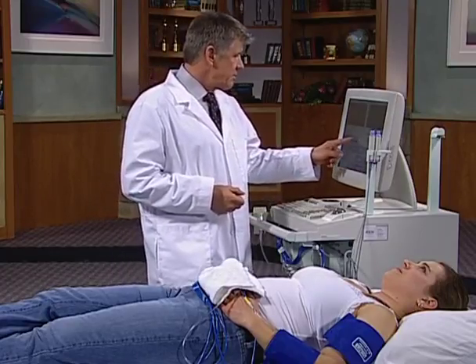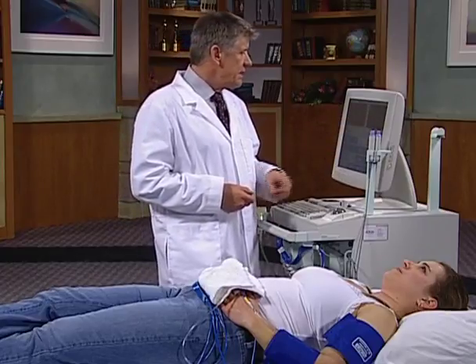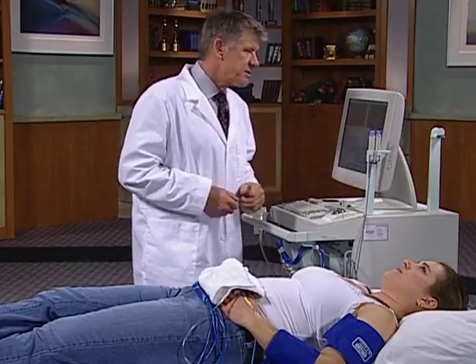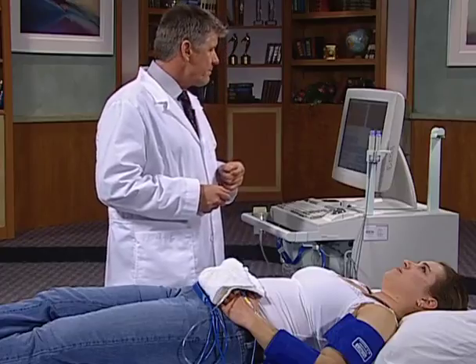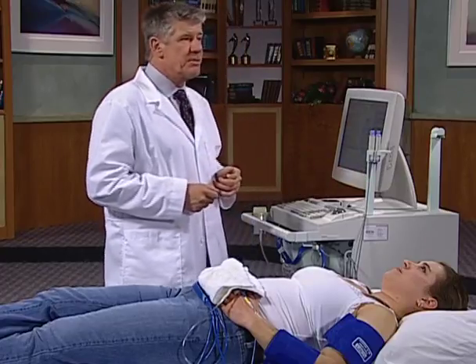I think we can do this with both images. We'll scan these back to the beginning so that we can mark the first pulse. So this is the first pulse on the right side. This is the first pulse on the left side. So it looks like the pressure on the right is 109, the left is 104. So we'll save those by moving on to our next location.